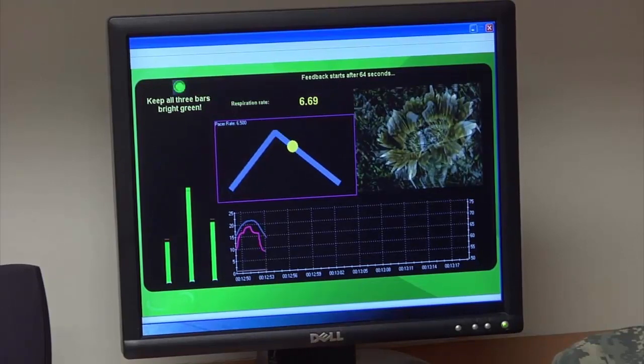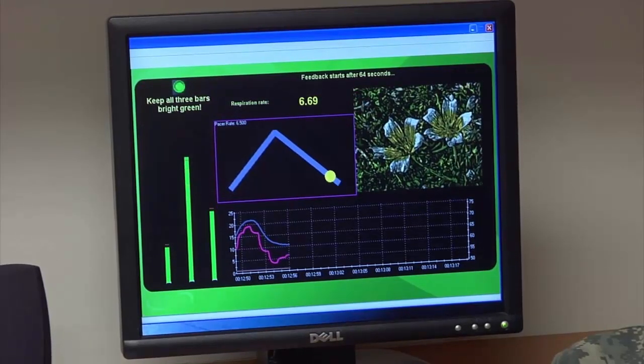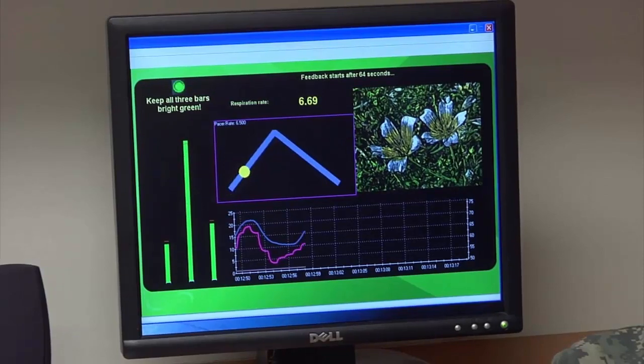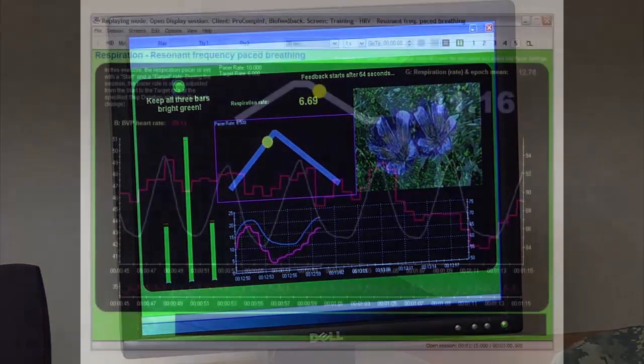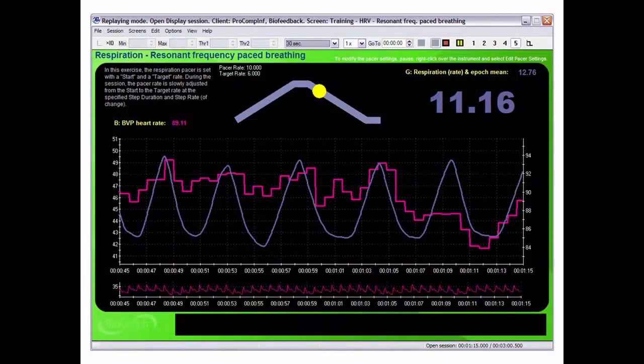The relatively smooth blue line represents respiration, whereas the pink jagged line represents heart rate variability. The respiration rate is at the top right side of the screen.